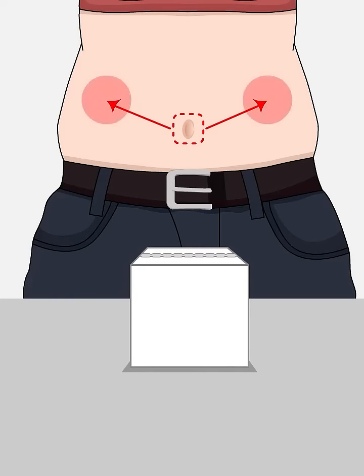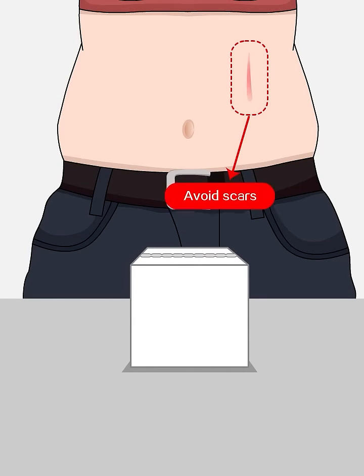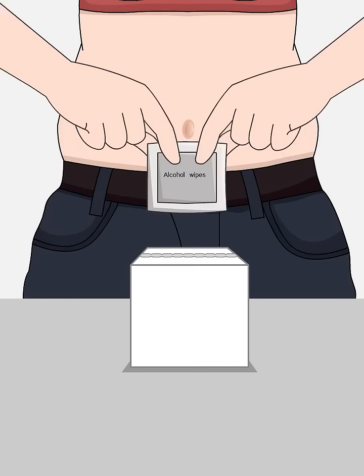Choose a site over 5 cm away from the navel — it is better to choose a site above the navel and below the ribs. Avoid belts, waistbands, scars, etc., and disinfect the area with alcohol wipes.